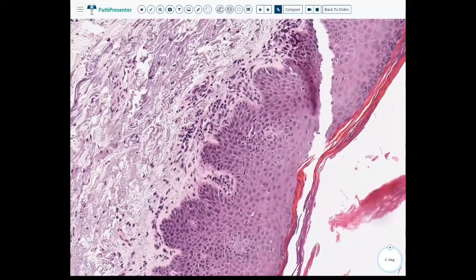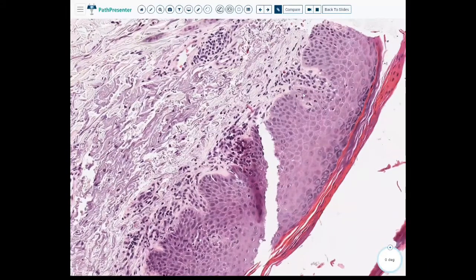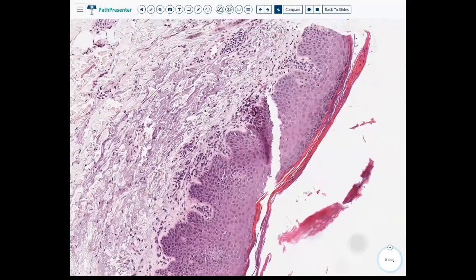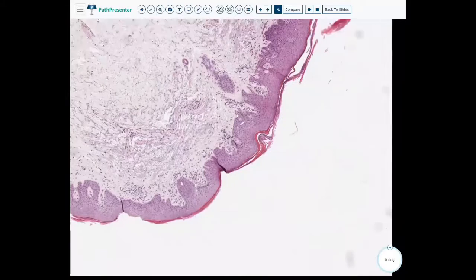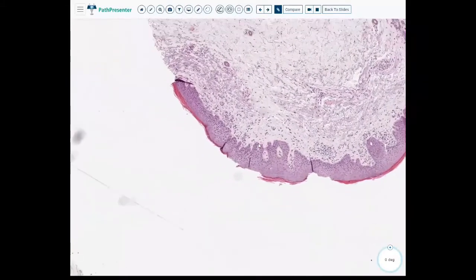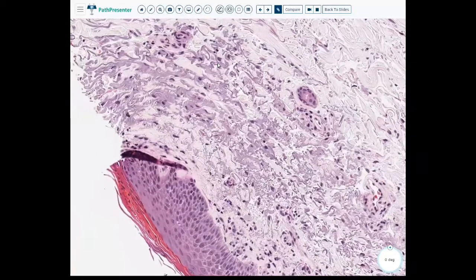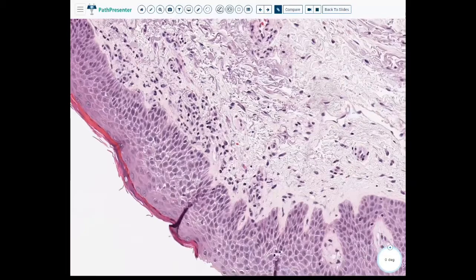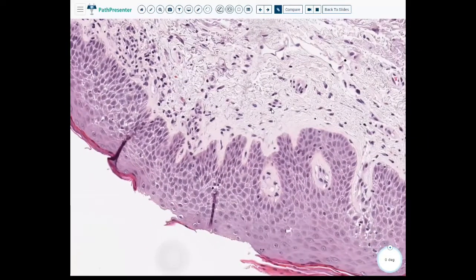Okay, well, there's one. That's an eosinophil. Okay, maybe there's a mound, and it is on the edge, but maybe we can envision that that would be a cleft. But this is by far a much more subtle example of, there's some more RBC extravasation, but this is a far more subtle example of pityriasis rosea.